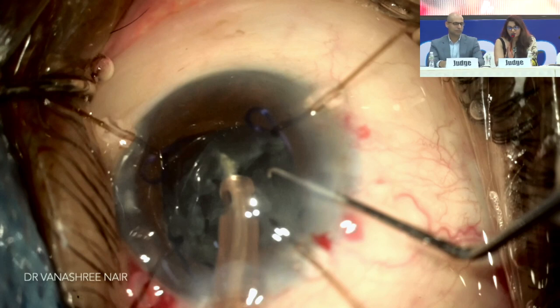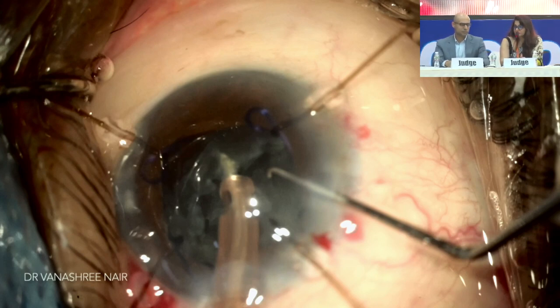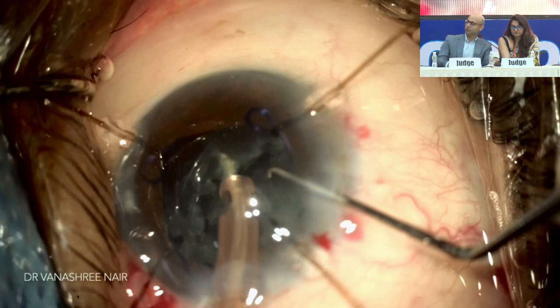What I do usually is start from the main wound, because for me ergonomically that becomes better. And I make sure once I go inside, I just try to tilt it to make sure that I am in the bag and not in the sulcus. And for the distal end, before I go into it, I take my second instrument in the hand. So with the IOL dialer, I try to give the support. Good. And with the Sinsky hook, I put my Sinsky hook into the hole and then put it down and then release it. Actually, a Kuglin hook works even better, because then it won't slip at all.